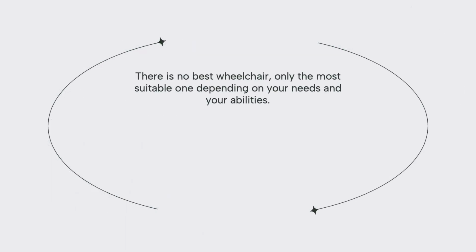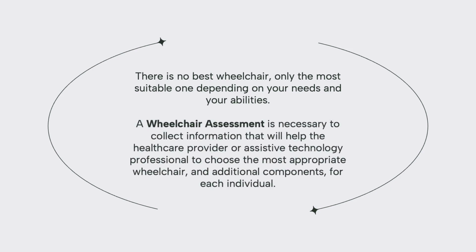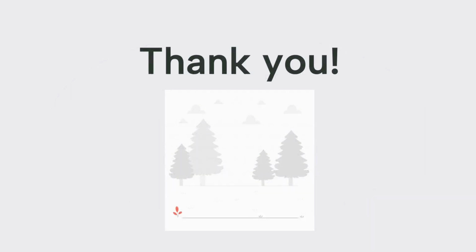Keep in mind that there is no best wheelchair, only the most suitable one depending on your needs and your abilities. A wheelchair assessment is a necessary process to collect information that will help the healthcare provider or assistive device professional to choose the most appropriate wheelchair and additional components for each unique individual.